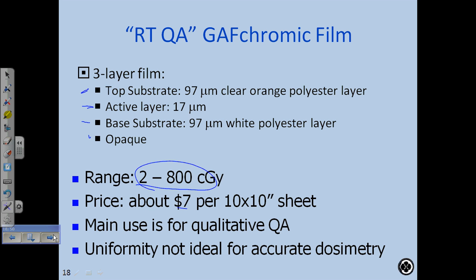Okay. We also use our TQA film for star shots. You can also use it for a star shot, that star pattern. Have you guys done a star shot? We did it with just paper. You did it with paper? Yeah. Okay. You can do it with paper. That's fine too, for spot checks.